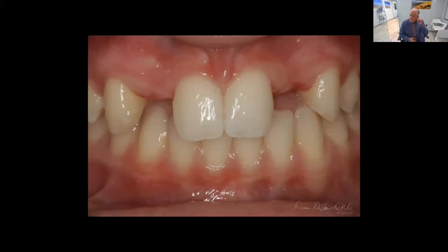So Samantha presented congenitally missing teeth number 7 and 10. And what we did for a period of time for her until she was old enough was, after she had gone through orthodontic treatment, we just fabricated 2, we call them one-wing Maryland bridges. And if you have any CAD/CAM technology in office, they're really easy to fabricate. And that's what she wore. She wore those temporary restorations until she was old enough for implant placement. And she was 18 years old, and this is where we are at this point right now.